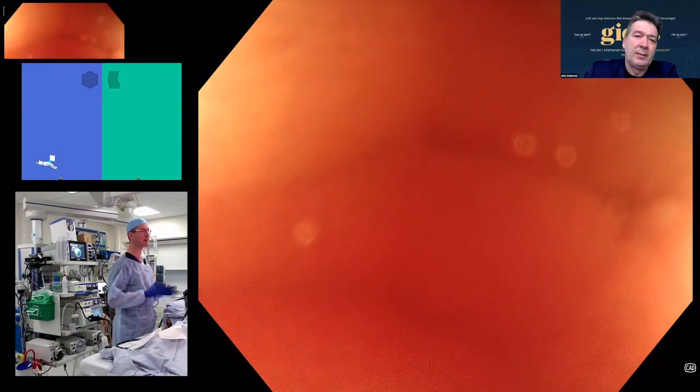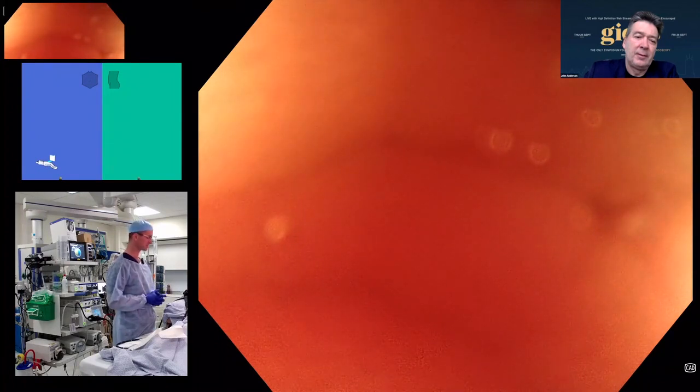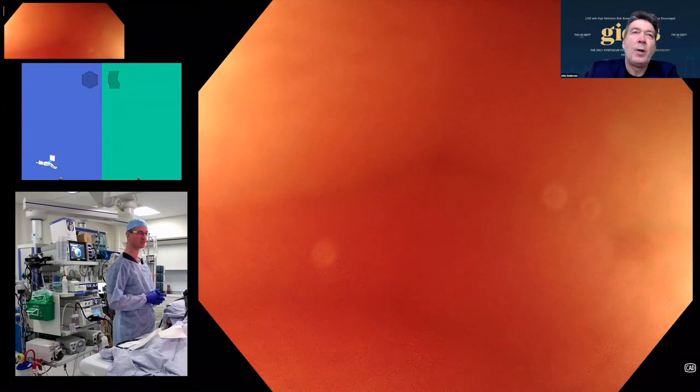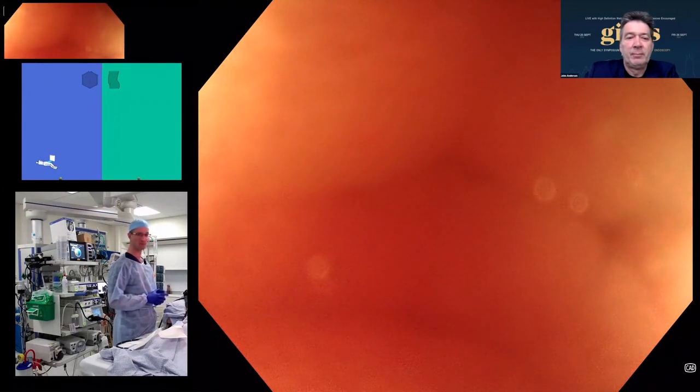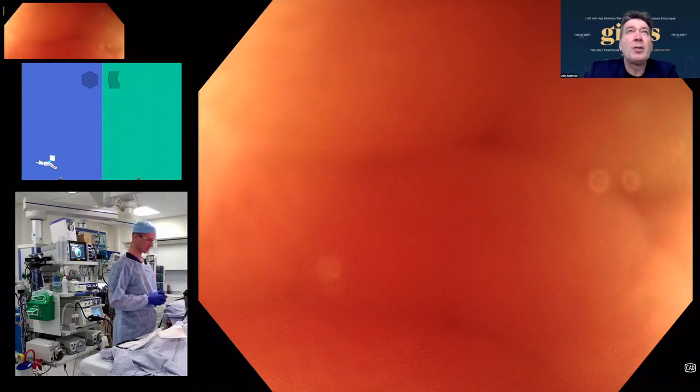Well, actually, I don't have a firm knowledge on that, but if I hear this question, it suggests to me that maybe a PCF would be a better choice. Why have you said that? Well, because the PCF is 1.5 millimeters less in diameter. So do you think there's going to be a stricture? Is the diameter of the lumen going to be an issue? No, actually not.